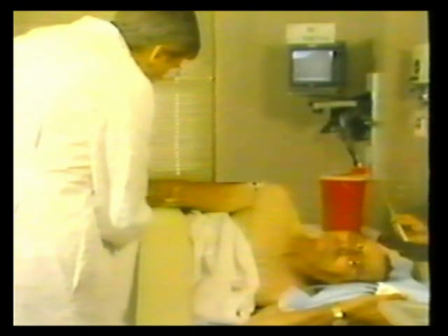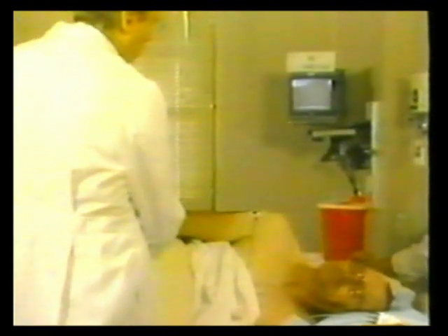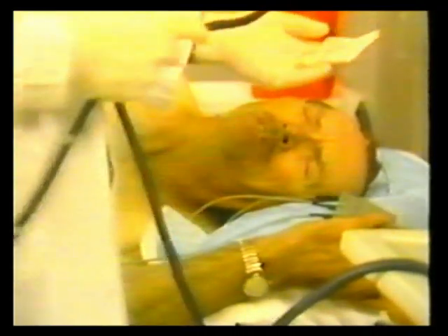We also use this site for contrast echocardiography, which has been illustrated earlier in this tape series. In this particular patient, we used approximately 2.5 milligrams of midazolam. The patient is sedate but cooperative.